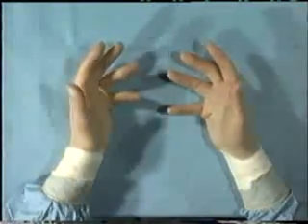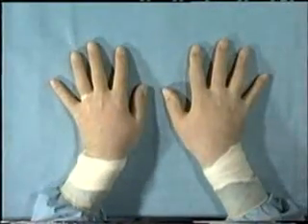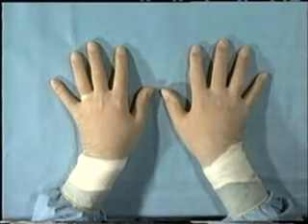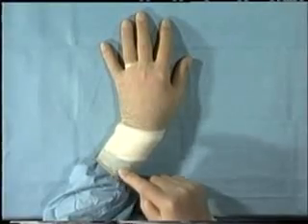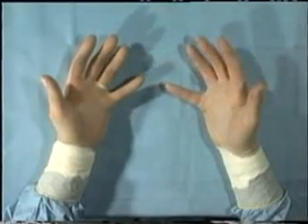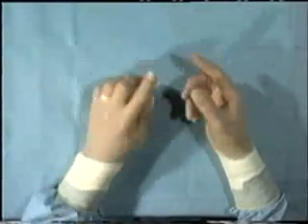During this course you will be handling animal material. Therefore, it is essential to wear well-fitting gloves and aprons at all times. In the operating theatre, ensure that the gloves are pulled up over the cuffs. To maintain your fingers' sensitivity, ensure that there is no excess glove material at the tips of the fingers.